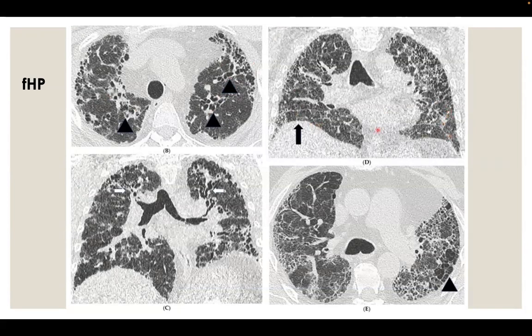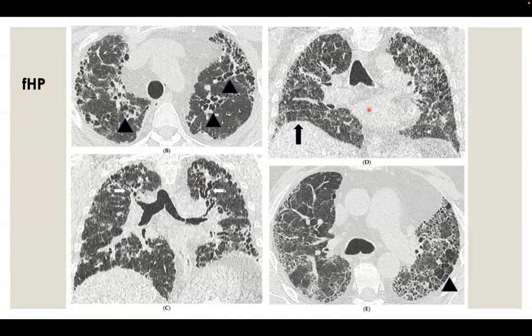Relatively spared lung bases — and this is not the apico-basal gradient we expect to see in typical UIP for IPF. Here again we see the bronchocentric distribution along the bronchovascular bundles. In this patient in the coronal view D and axial E at the level of the pulmonary arteries, we see bronchocentric distribution with presence of traction bronchiectasis, irregular reticulation, and ground glass along the bronchocentric distribution.